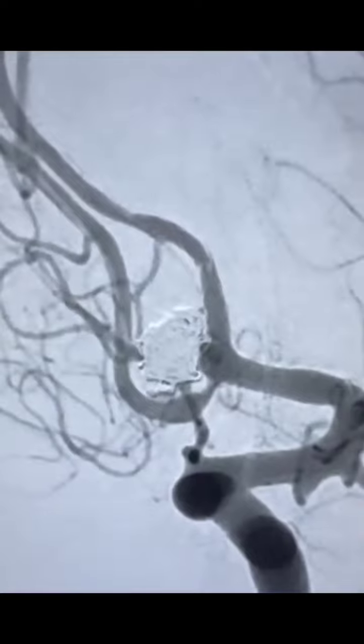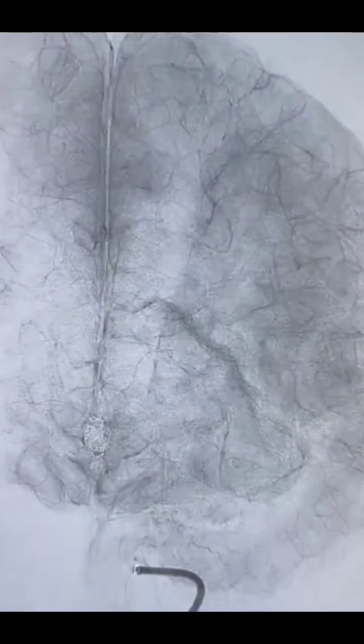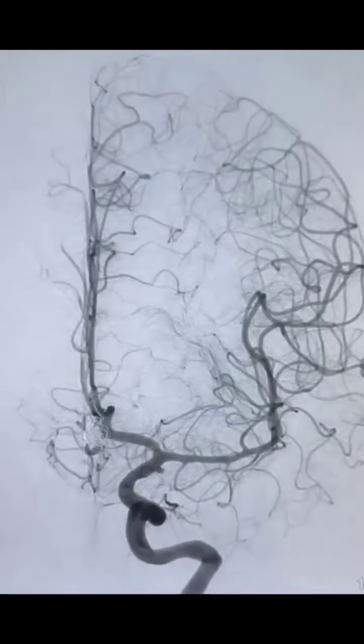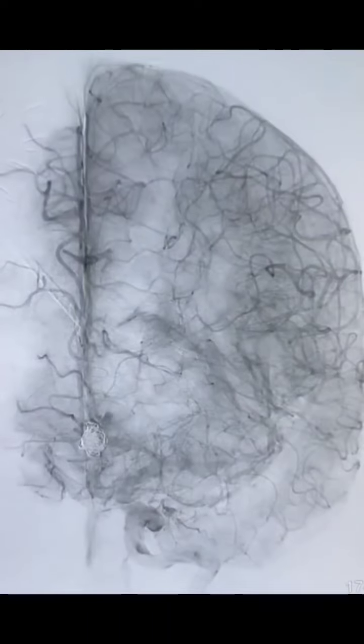Initial post-procedure angiography showed there was a clot in the ACOM region and along the left and right A2 ACAs. The patient was kept on Tirofiban infusion, and a few hours later a repeat angiography showed there was decreased flow in the right A2 ACA. Intra-arterial milrinone was administered and Tirofiban infusion was continued.